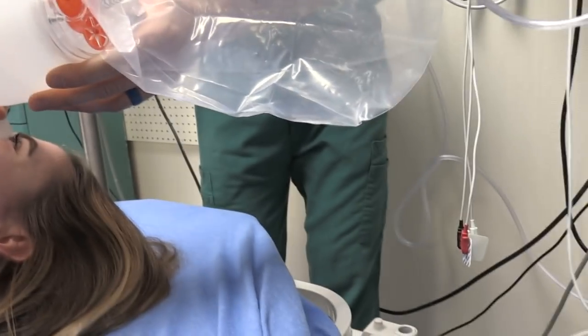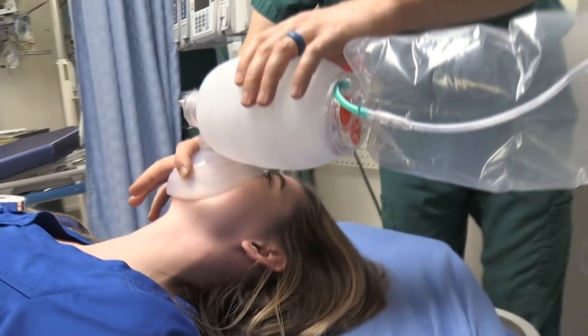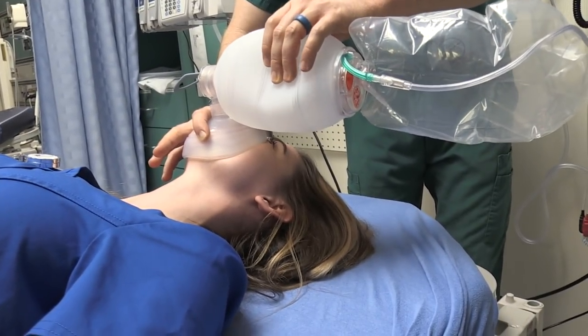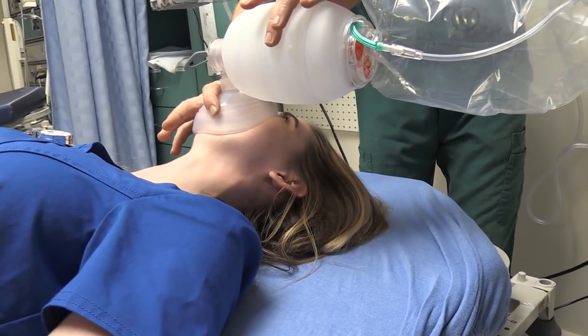Okay, now I want you to bag for her now. We're just going to give you a little bit of air when you breathe in. Do you feel that little bit of pressure? Is it a lot? A little bit, yeah. Okay.